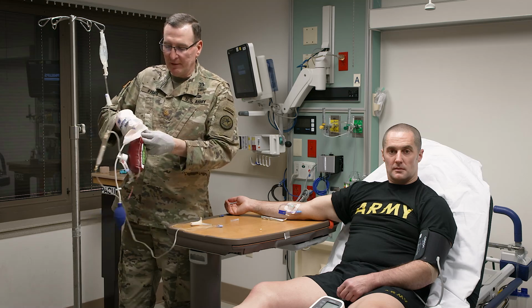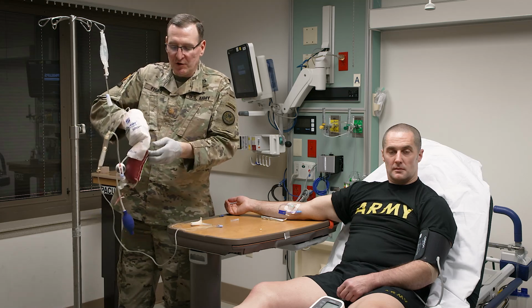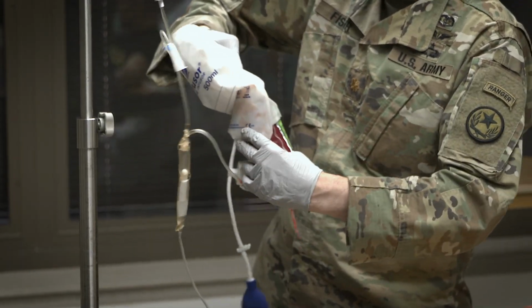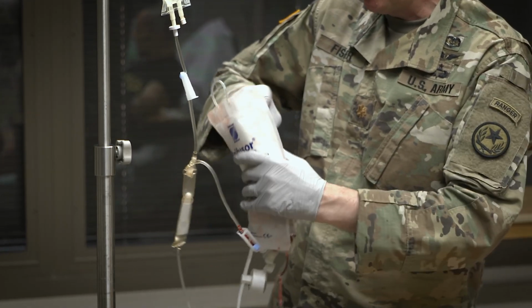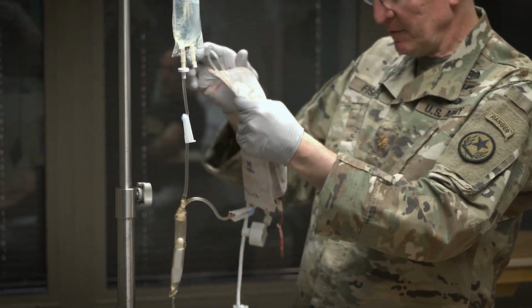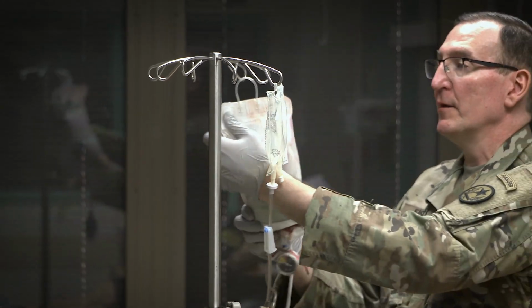because I want to make sure that I run a little bit of blood through my patient to make sure there's not going to be a reaction before I pump this up and rapidly infuse this transfusion. There are a lot of different types out there, including different types of pumps. Just make sure you're familiar with what your unit has and learn how to use it. Okay, now we're set.